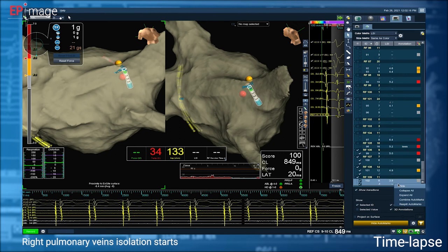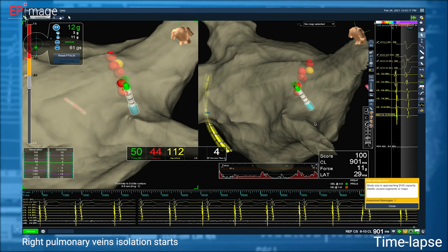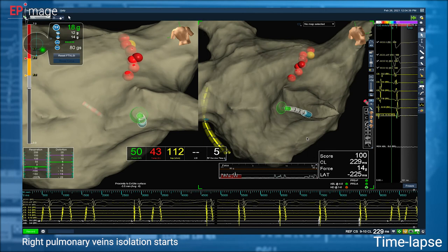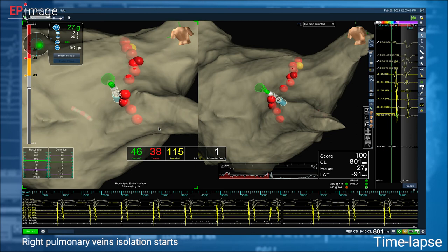So we finished with isolation of the left pulmonary veins. We've moved to the right pulmonary veins now. So again, I'm starting on the posterior wall. And with this huge left atrium, sometimes the displacement of the esophagus is more to the left or more to the right than in the middle.